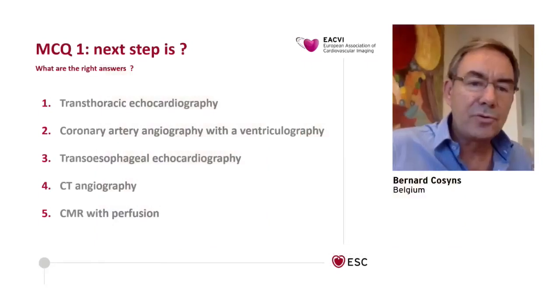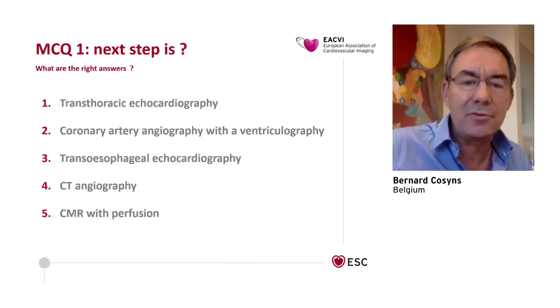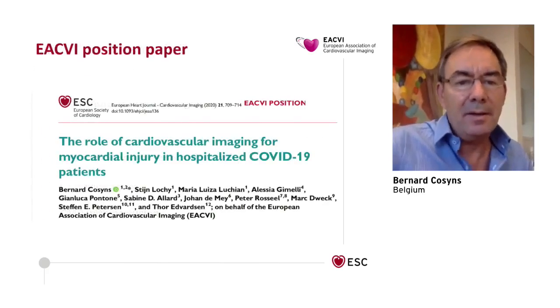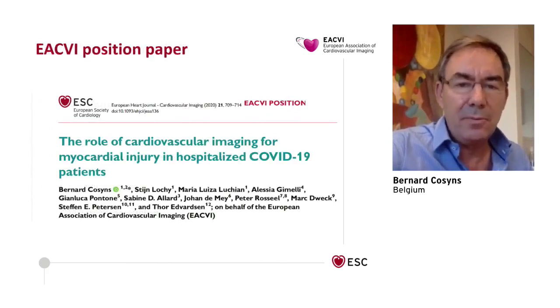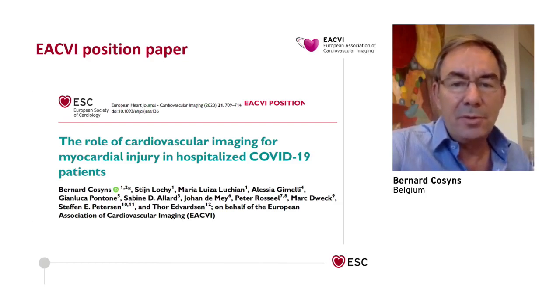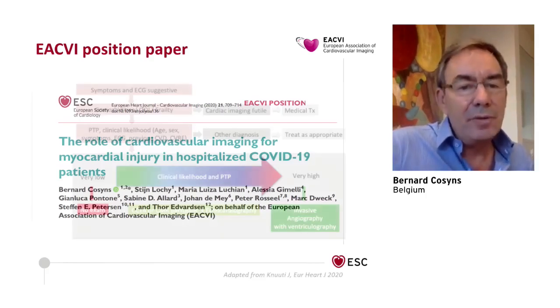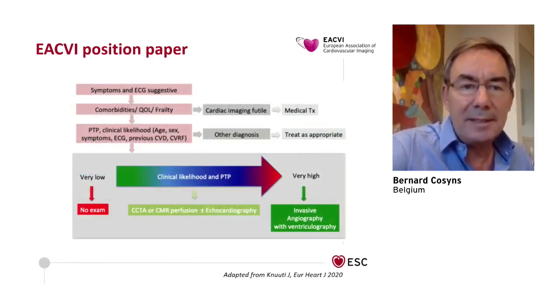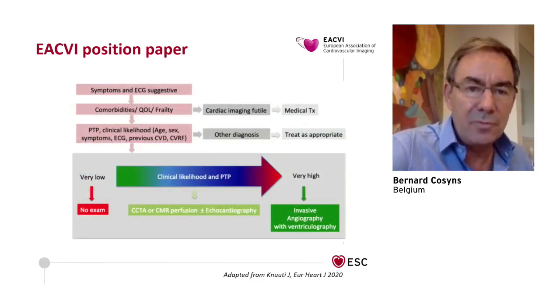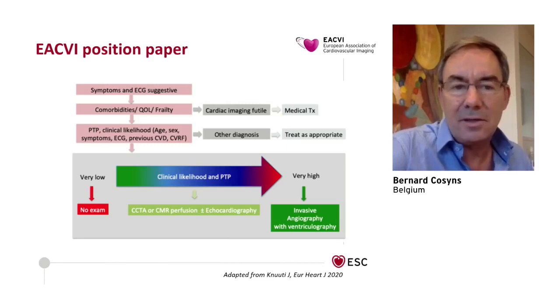So in fact, almost all proposals were more or less correct, except probably transesophageal echo. As you may know, because we were faced with this problematic of myocardial injury and a lot of demand regarding echocardiography in this setting, we have produced a document, a position paper, in order to provide some guidance. And I will refer to one of the tables that was adapted from the guidelines on chronic coronary syndromes, where in fact you have to look at the symptoms and the characteristic of the ECG.